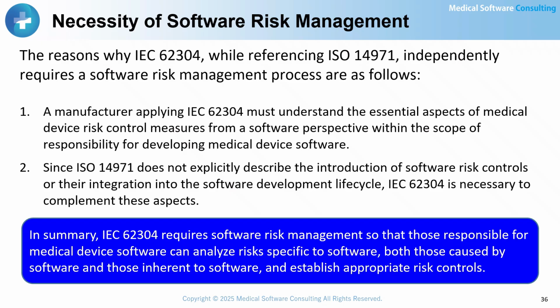Software risk management is part of the overall medical device risk management process, and it is difficult to separate the two. IEC 62304 references ISO 14971 and requires the use of a risk management process that complies with ISO 14971. At the same time, IEC 62304 independently requires a software risk management process. There are two main reasons for this.